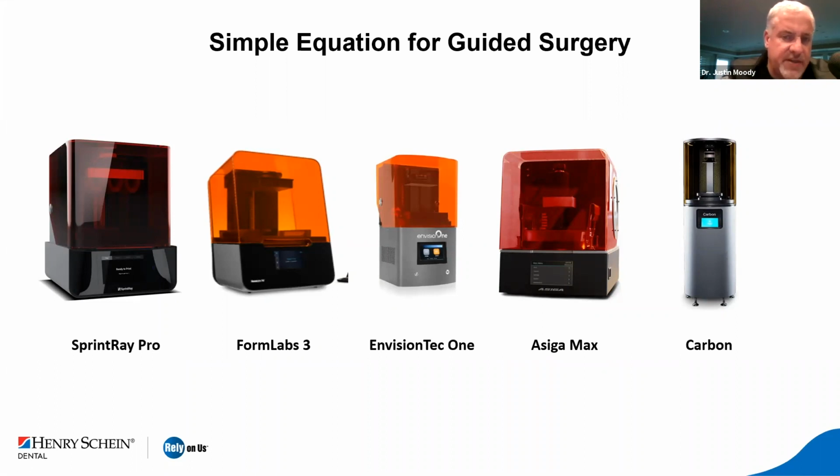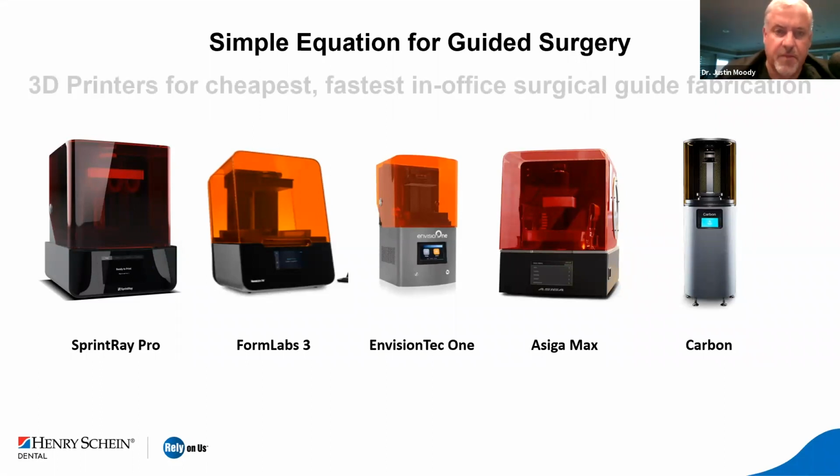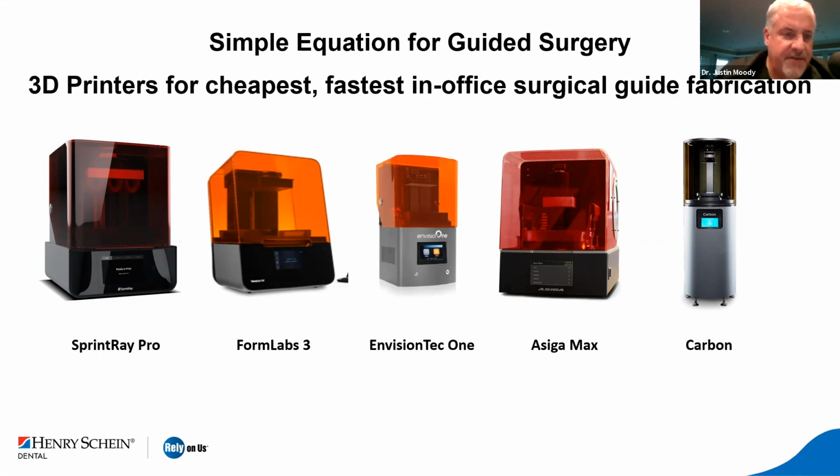I've owned a number of these on the screen. Today, we've settled in on the Sprintray Pro. We're going to go over that and some of the new features that it has as well. I think that you'll find quite interesting. These have definitely come down in price over time.